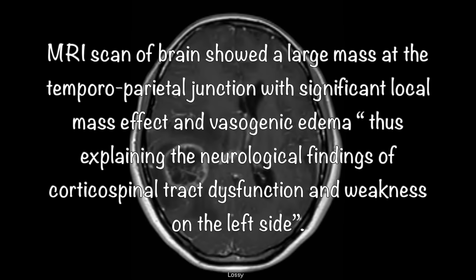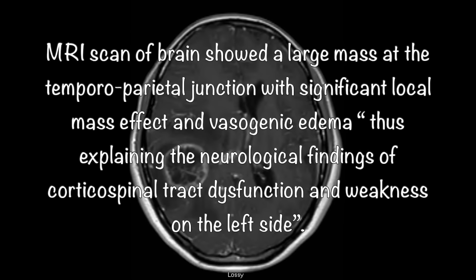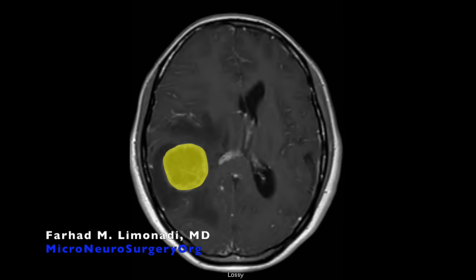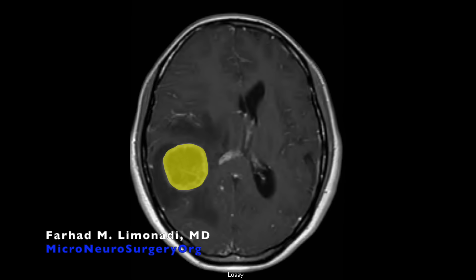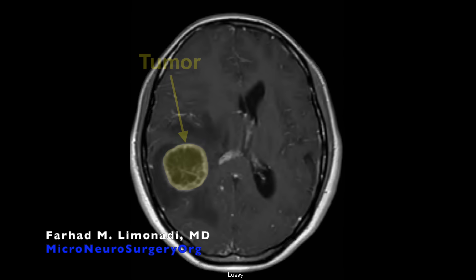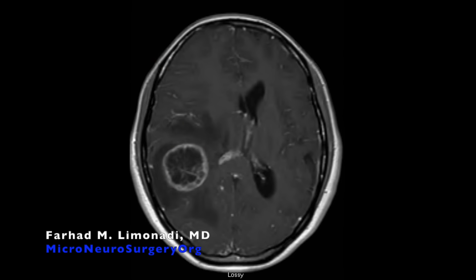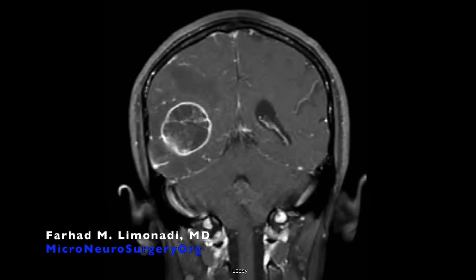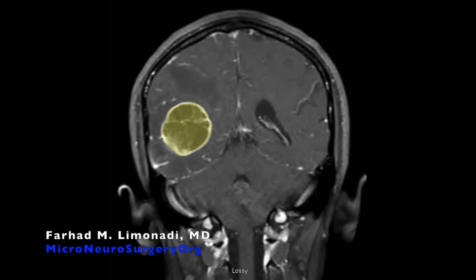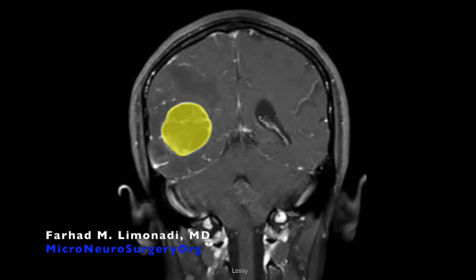MRI scans of the brain showed a large mass at the temporoparietal junction with significant local mass effect and vasogenic edema, explaining the neurological findings of corticospinal tract dysfunction and weakness on the left side.